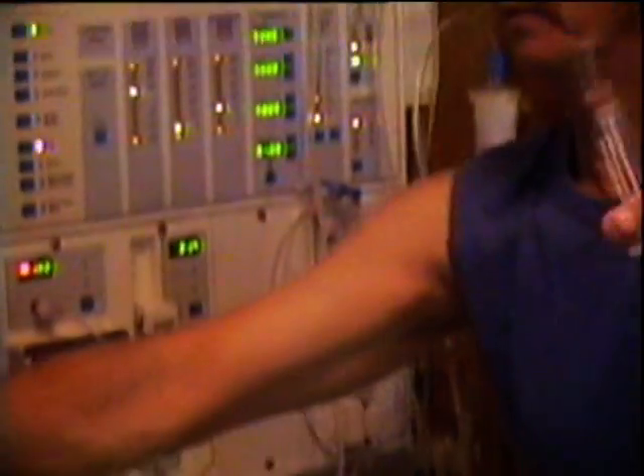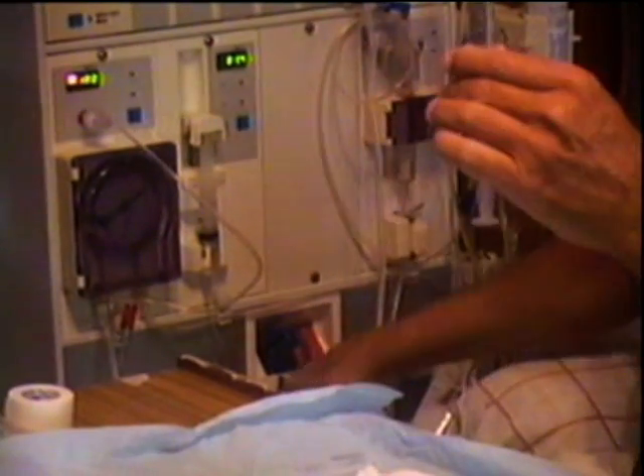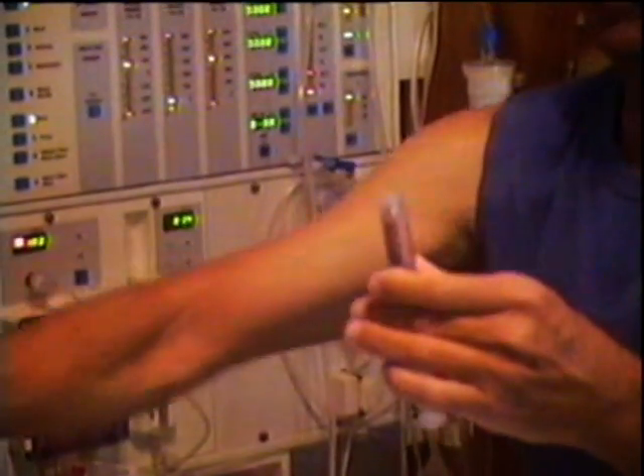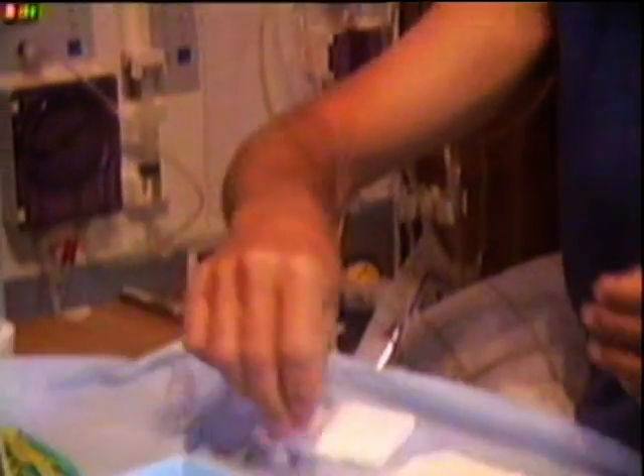Now I've got ten mixed together. Take that needle off and put it in the needle bin. Now that's ready, we'll just put that down there.